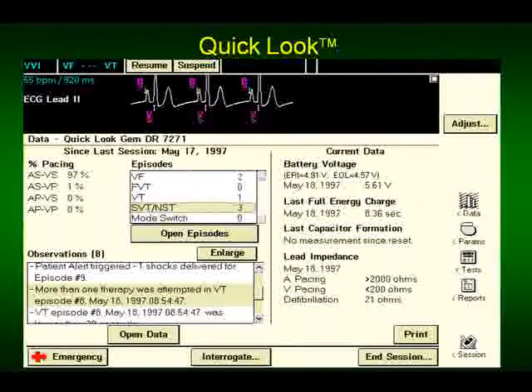And then you get a different looking screen with different terminology that means the same as the prior screen from Boston Scientific, which is still different than Biotronic and is still different from St. Jude. So you really have lots of problems. This is all proprietary stuff. It's very difficult to manipulate this, but you should know the basic functions.